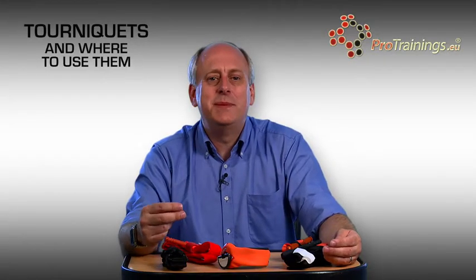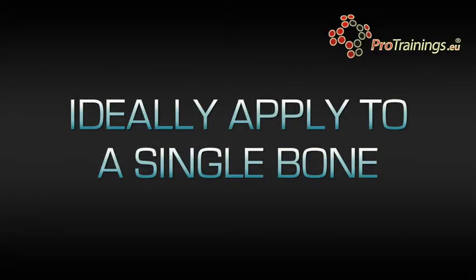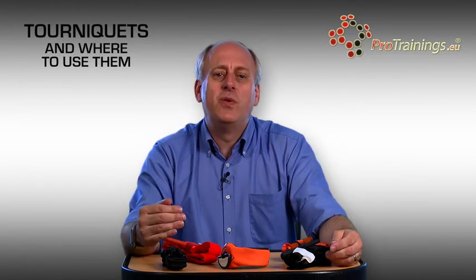The tourniquet needs to be applied direct to the skin ideally, although it can be applied over clothing. But make sure there are no injuries above the application site which could be hidden by the clothing. Tourniquets are ideally applied to a single bone like the upper arm or the thigh bone, because if you apply them to the lower arm or the lower leg, the arteries may not be stopped as they're protected by the bone. Apply the tourniquet at least 5 centimeters above the joint of the knee or the elbow to avoid damaging the joint when it's tightened.